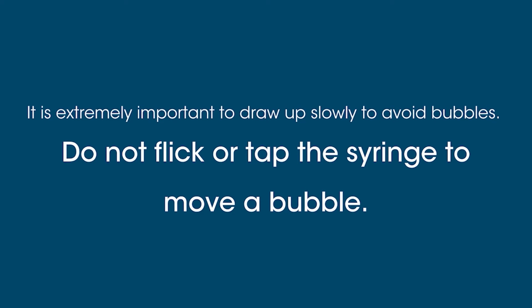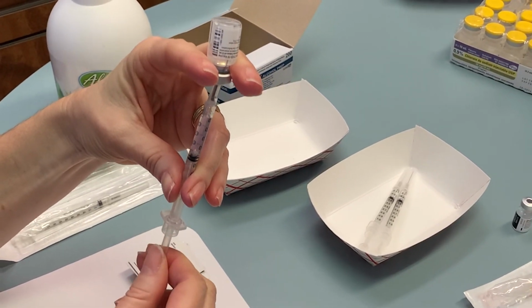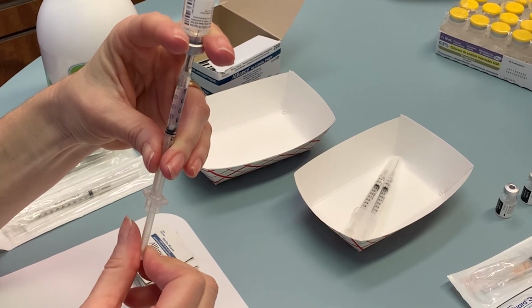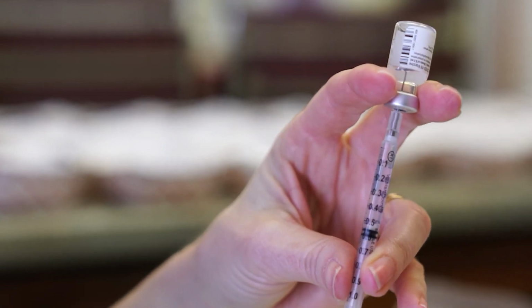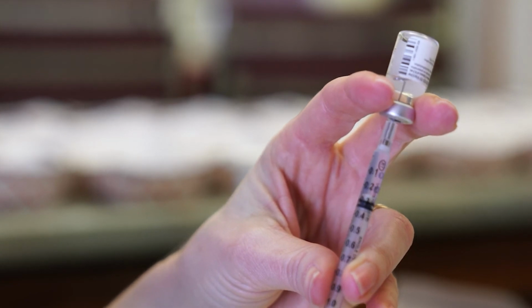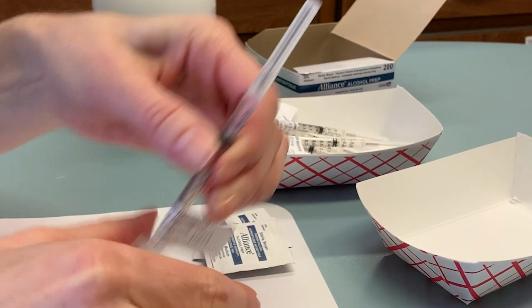It is extremely important to draw up very slowly to avoid bubbles. You should never flick or tap the syringe to move a bubble. If you do happen to get a bubble in your syringe, gently pull back farther than the 0.3 mark and slowly move the plunger, twisting in your fingers to help force the bubble to the tip of the needle. Once it is at the tip, slowly push the plunger back to the 0.3 mark. Never withdraw your needle from the vaccine vial until your dose is perfectly at 0.3 mL with no air bubbles. Label the syringe and repeat this process.